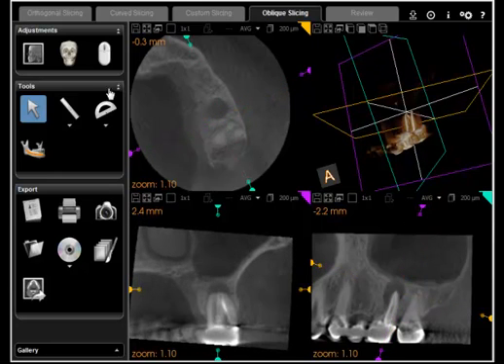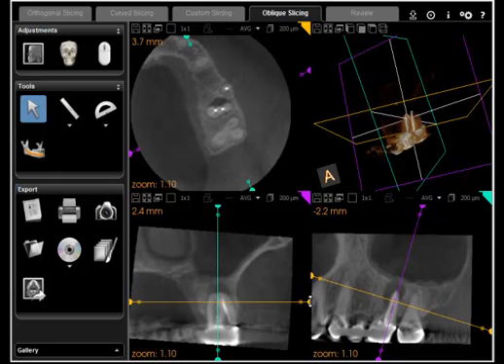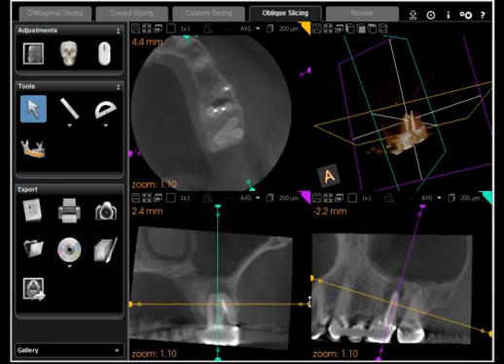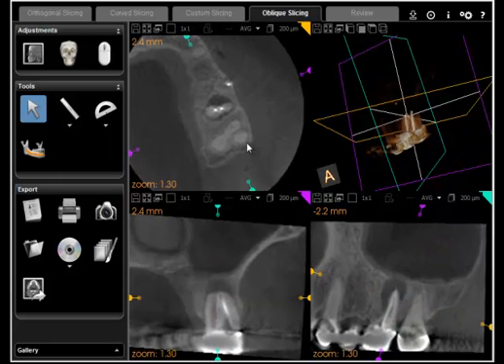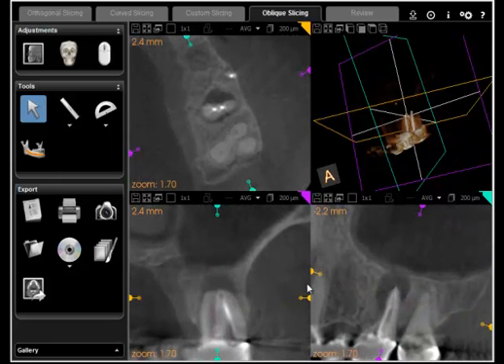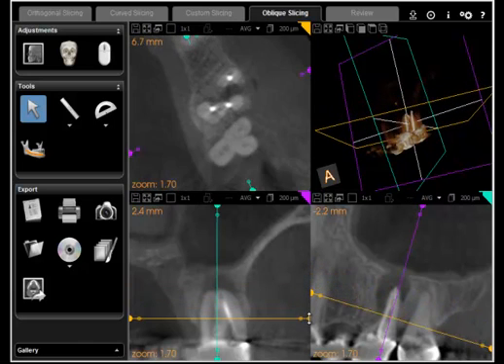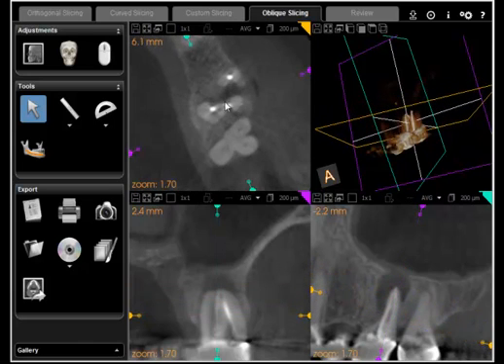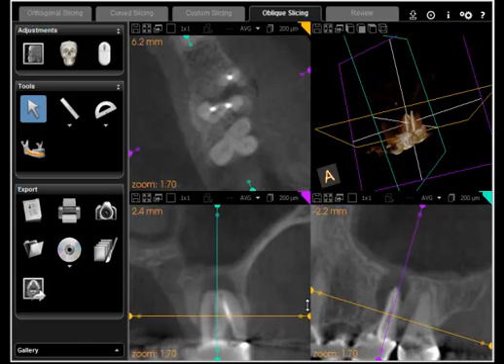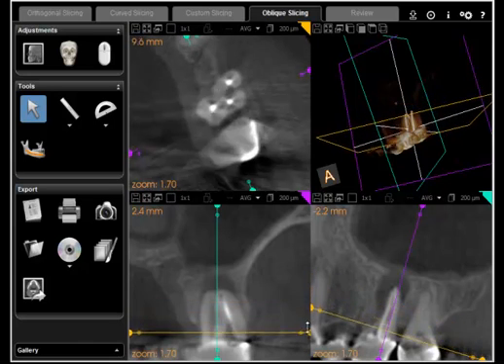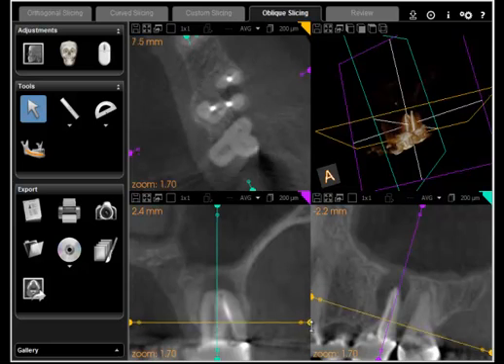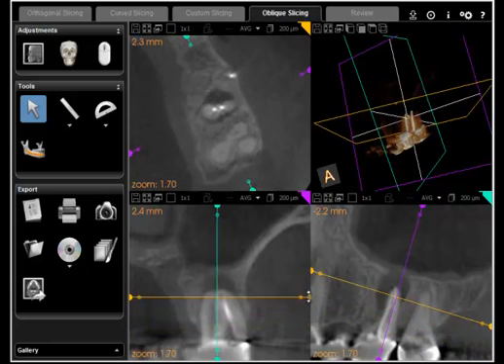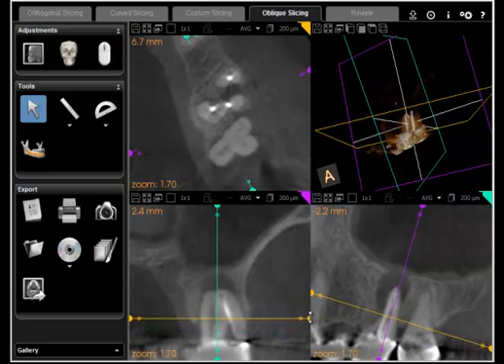The axial view is especially useful in looking for bone loss caused by vertical root fractures, as well as missed canals. You can usually see the position of the root canal fillings and the number of them. As you can see, the distal buccal and palatal root were fused in this case, and they appear to be fairly centered in the canal. Concentrating on the mesial buccal root as I manipulate the image up and down, we notice that the root canal filling is fairly well centered in that root.